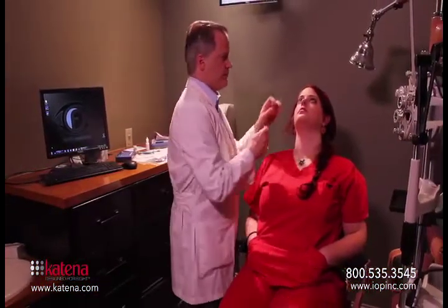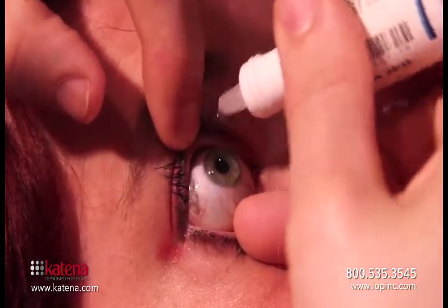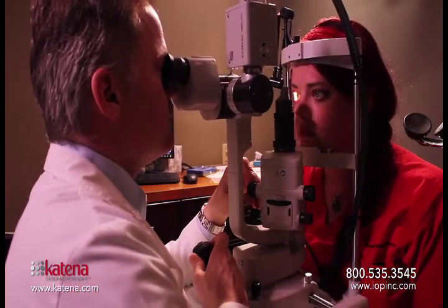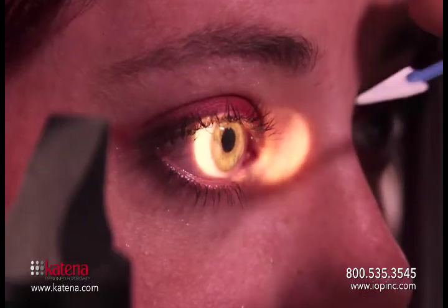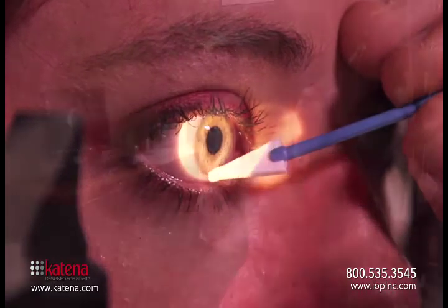Here we're putting a drop of tetracaine in the eye to prepare the surface of the eye. I usually put this in before opening the product to give the drops time to take effect. After you've anesthetized the eye, you'll want to take a look at the eye through the microscope and really dry the surface out. You don't want to put the AmbioDisc on dead or dying tissue. You want to remove as much of that as possible so you get a good adherence of the graft to the cornea.